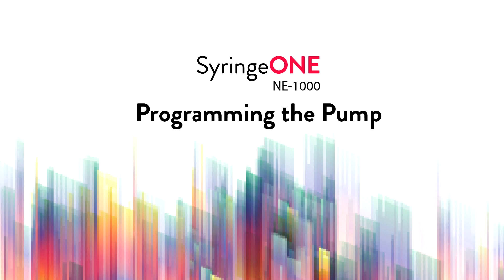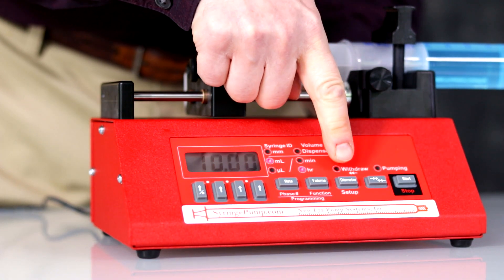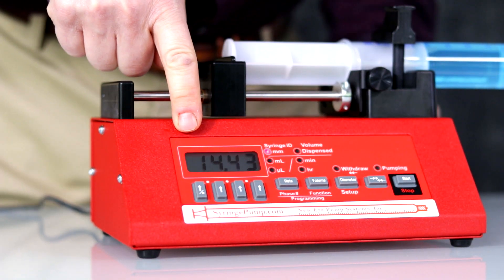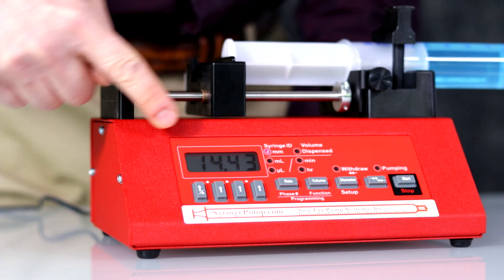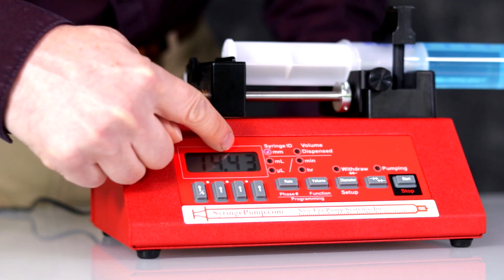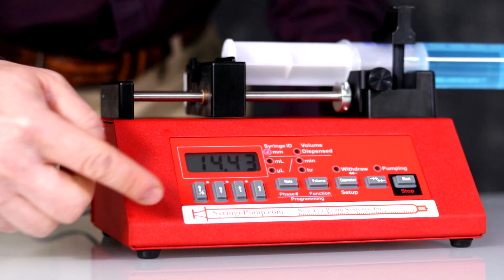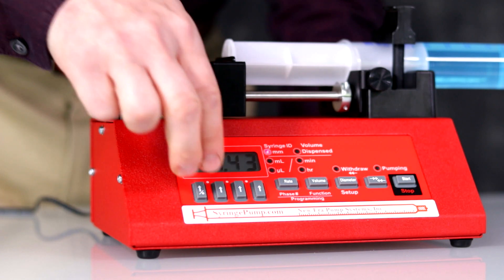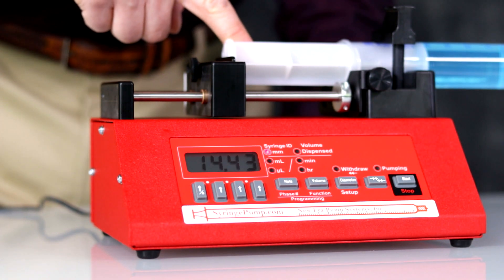NE1000 programming the pump. To program the pump, first enter the syringe diameter. Press the diameter key. It will display the currently selected diameter, 14.43 millimeters — this is the factory default. To change, use the up arrow keys to increment individual digits above each key. To set the decimal point, simultaneously press the two up arrow keys under where you want the decimal point to be. Press again to clear the decimal point. The syringe loaded has a diameter of 29.2 — you can find this information in the user manual.